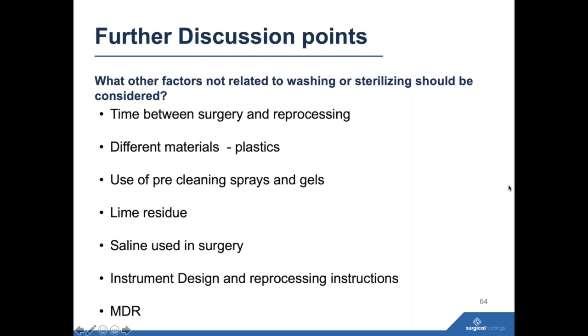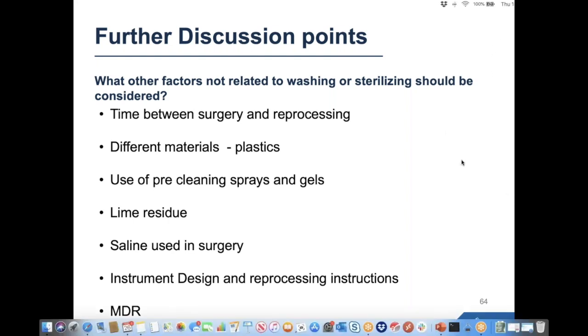It has gotten better. Most ORs that I work with have moved over to using sterile water as opposed to saline, except for open heart surgery, things like that. They're still using saline, which they need to. But yeah, you can definitely see a difference in those instruments where it's impacting the surface of the instrument. Okay, and that's something that's essential for them to use for certain procedures in open heart surgery? Yes.